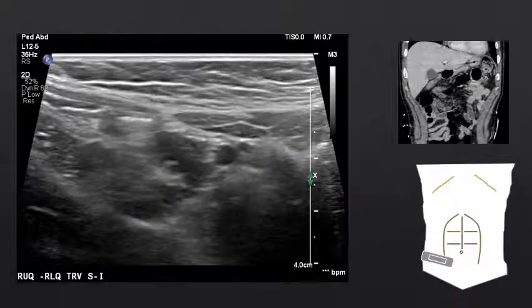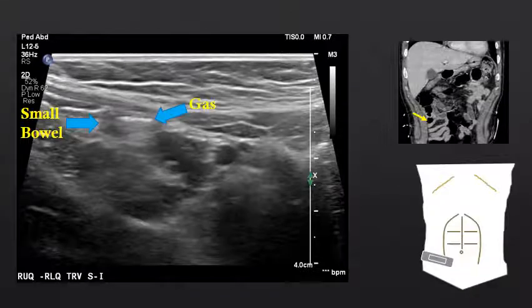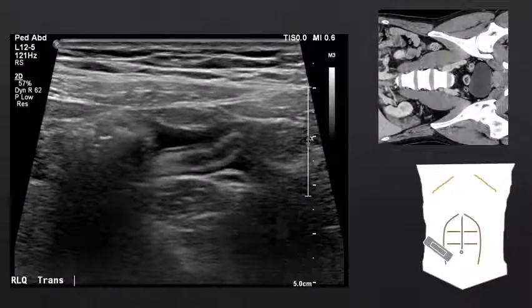Shifting the probe just slightly, we can now identify gas within the small bowel. We see the small bowel here, and then we see this area of echogenicity with shadowing.